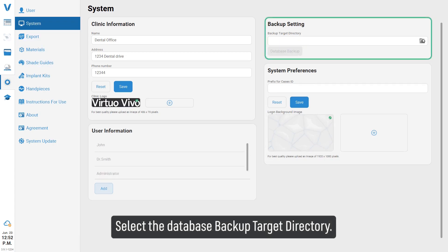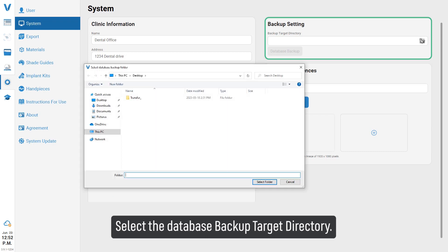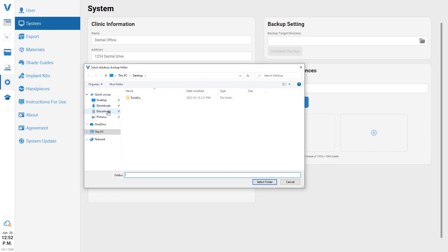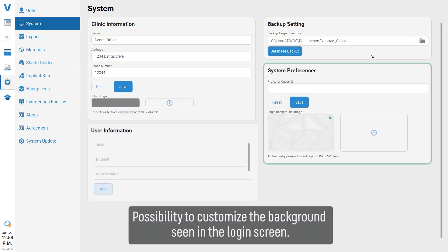Select the database backup target directory. There is also the possibility to customize the background scene in the login screen.